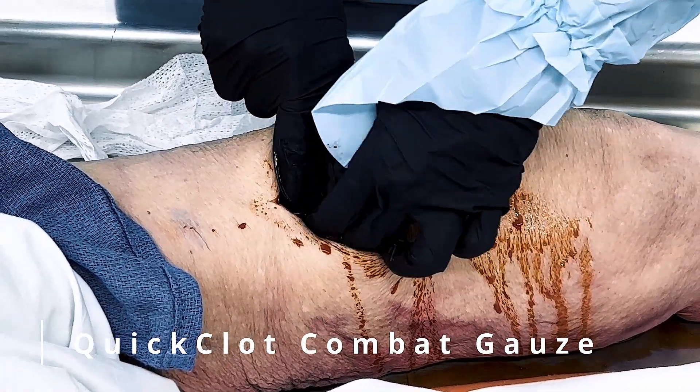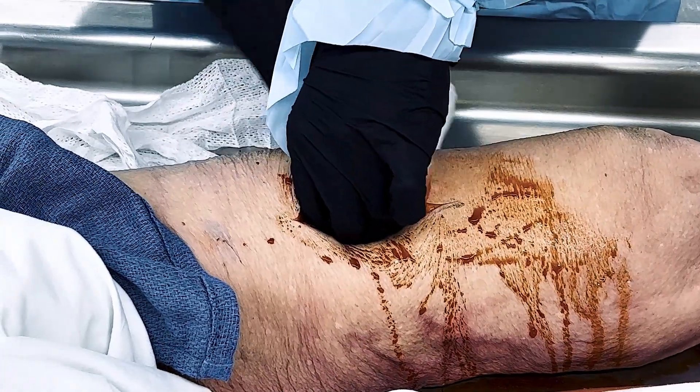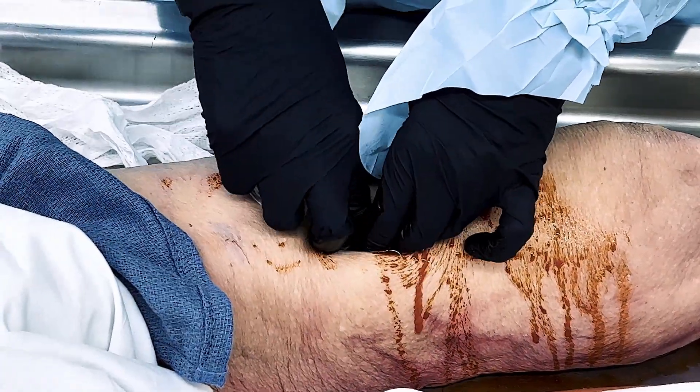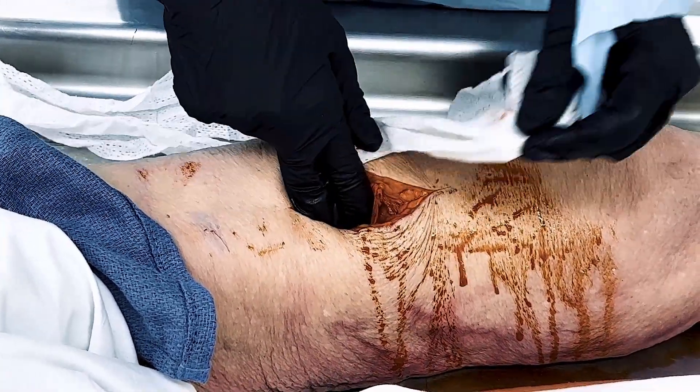Welcome to this instructional video on the proper use of quick clot combat gauze. In this demonstration, we'll go through the correct procedure for using quick clot combat gauze to control extremity or junctional hemorrhage that is uncontrolled by direct pressure.